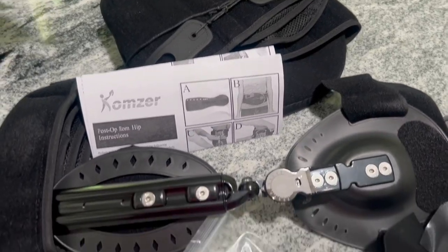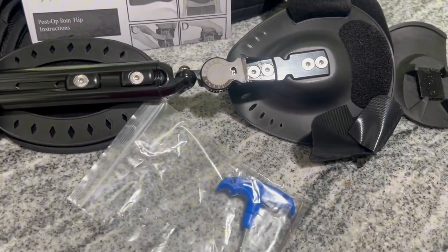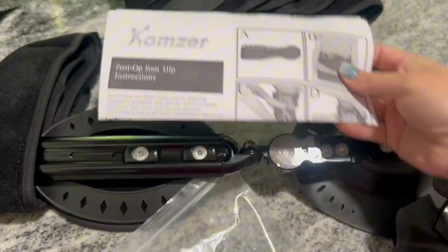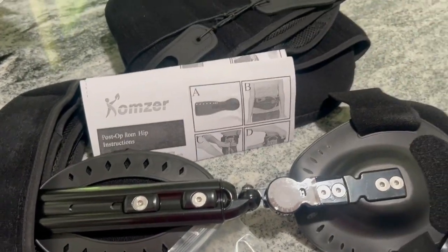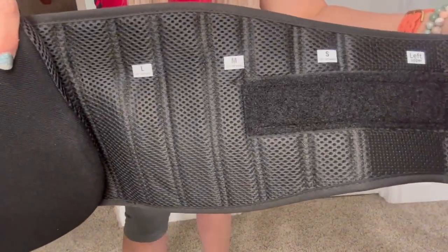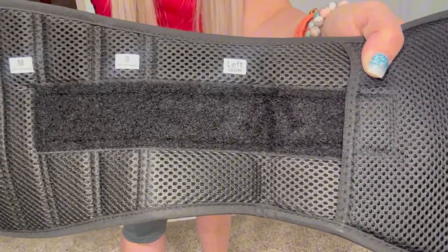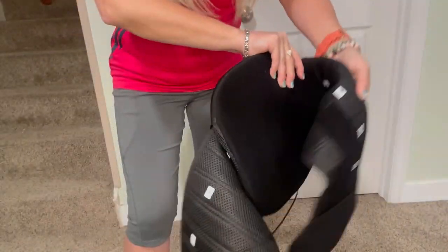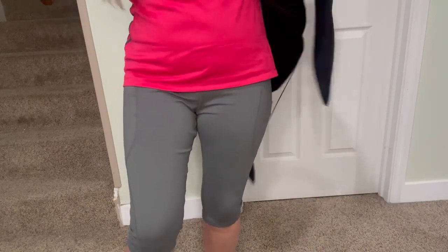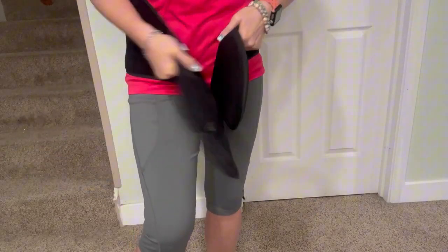This is an abduction hip brace that comes with everything that you need to be able to use it correctly, and it comes with very easy to follow step-by-step instructions. The belt itself comes in different sizing, going from extra large all the way down to a small, so you can adjust it around your waist as you need to. It's very easy to put on and the velcro is very strong.